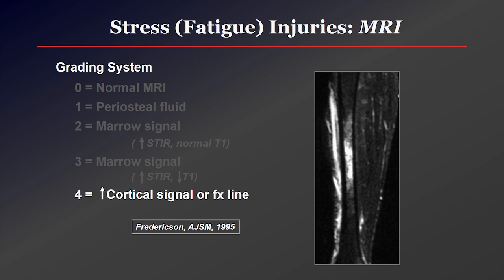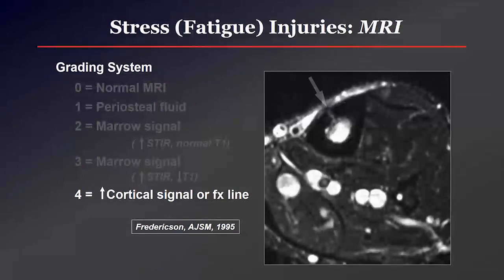Grade 4 involves any kind of signal in the cortex or a discrete fracture line. This was a 50-year-old cross-country coach who came in complaining of what felt like shin splints. He has very extensive marrow edema in his mid-tibial shaft, and on the axial scans we could see this longitudinally oriented vertical stress fracture in the anterior tibial cortex. In practice, if I see grade 1 or 2 changes I'll call it a mild stress reaction; grade 3 is moderate or severe; and if I see cortical signal or a fracture line I'll just call it a stress fracture.